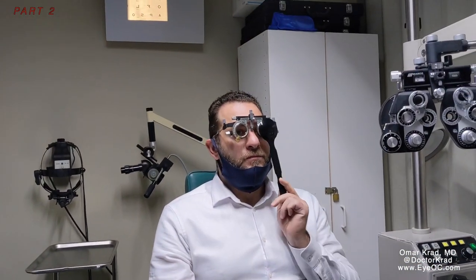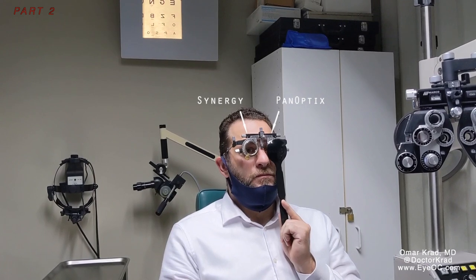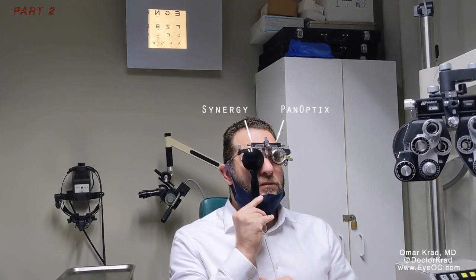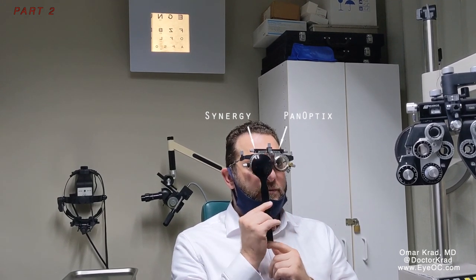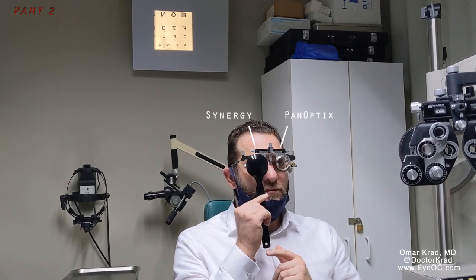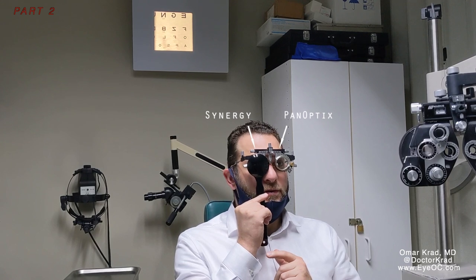Now looking way off into the distance. Cover your left eye, then cover your right eye, and tell me which one you like more overall. Pretty close — the right may be a little bit better. Yeah, so the right one is a tiny bit better. Is there a difference in brightness between your two eyes? No, I think it's pretty much the same.